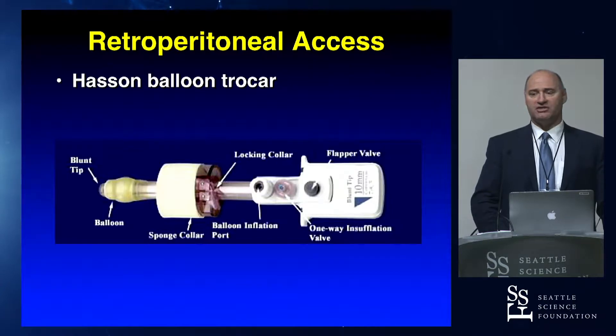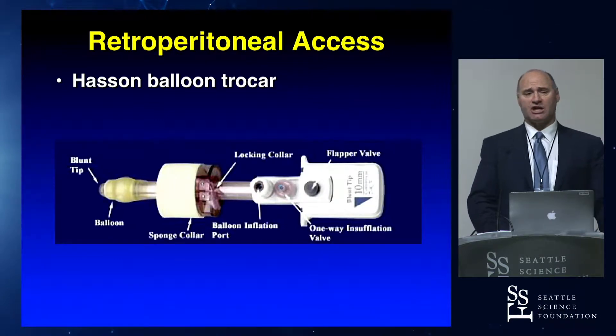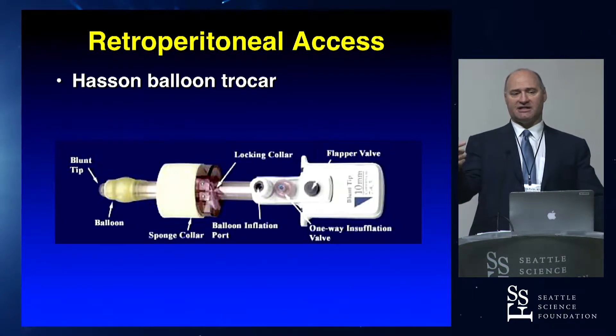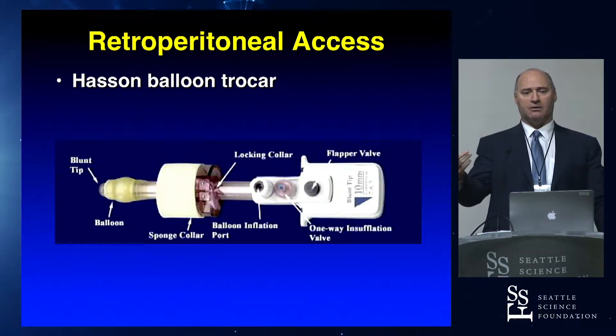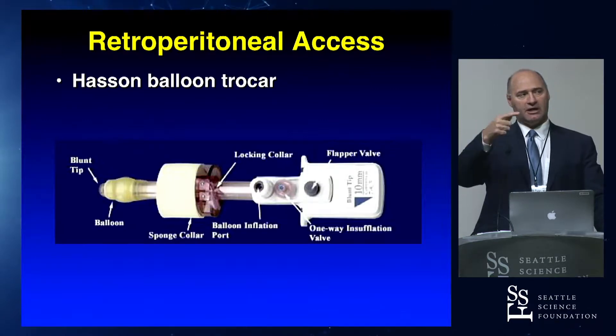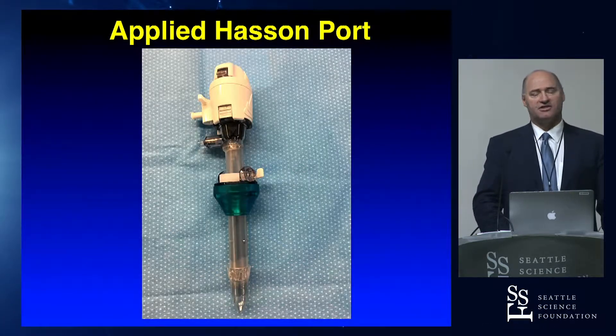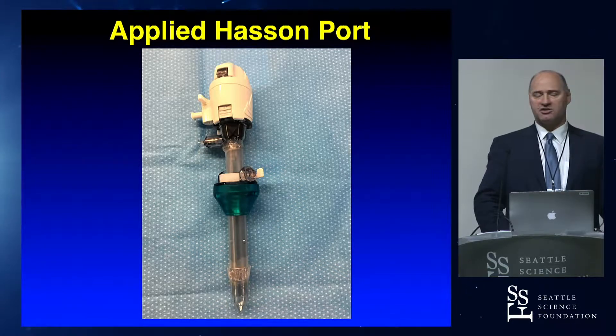If you're using the SI, this is the Hassan cannula I would use — basically a balloon port. It has a sponge collar on top, which creates a nice seal because you're making a cut-down incision, so there's a lot of possibility of leaking CO2. This balloon port does a great job keeping that from leaking. There's another version made by Applied that works as well — instead of a foam collar, it has a little gel collar. That works just as well.